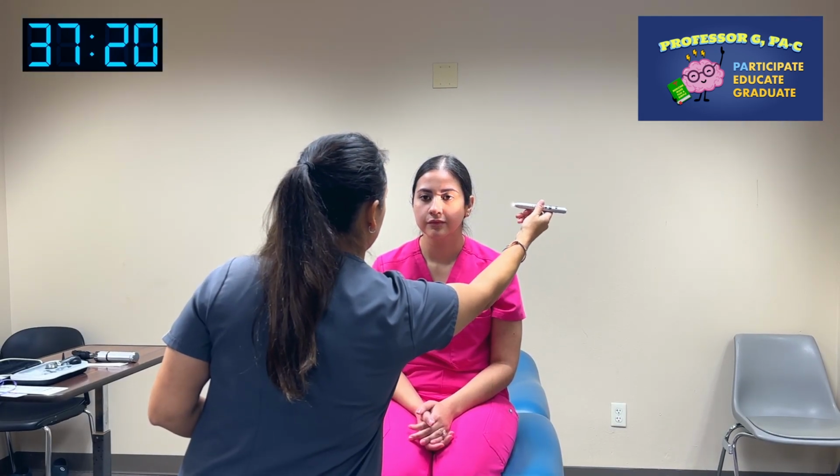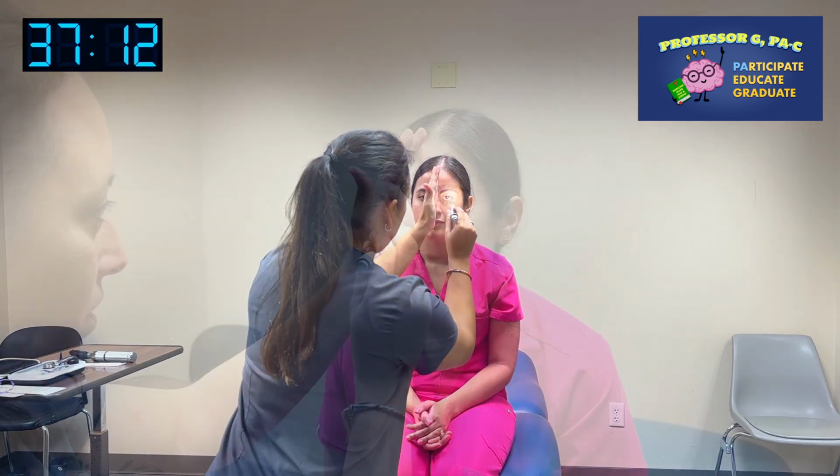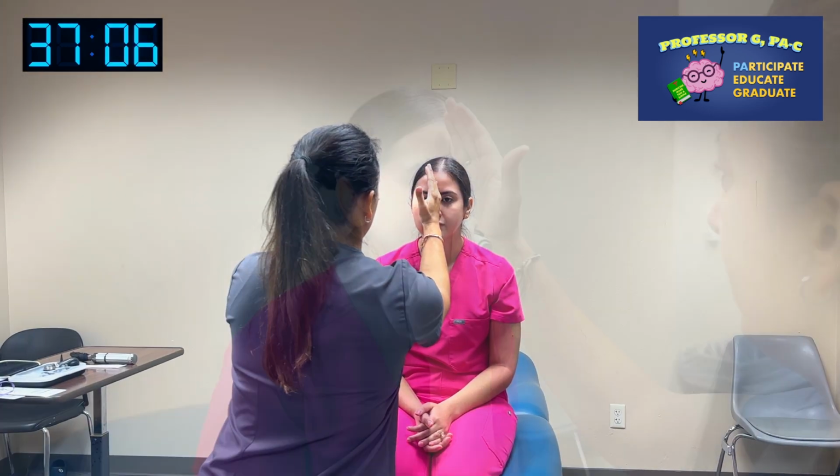Now I'm going to go ahead and shine the light in your eye. You can just look straight ahead. So normal eye position alignment. Normal anterior chamber and cornea. You can just look straight ahead for me. Normal direct and consensual pupillary constriction.